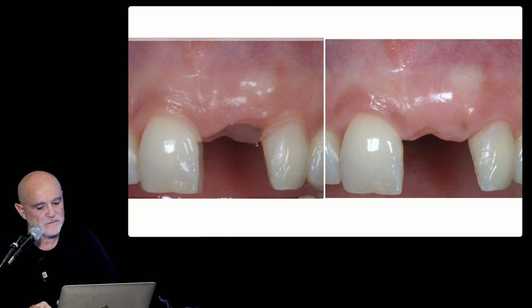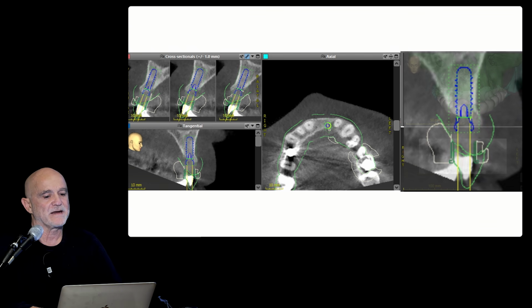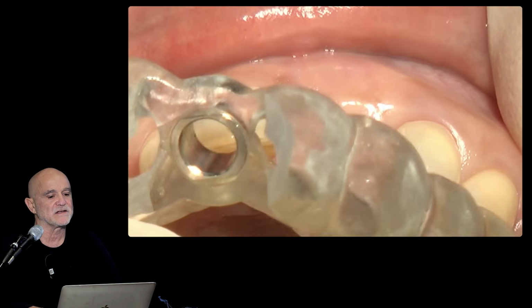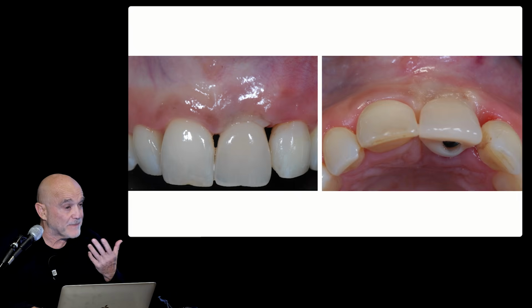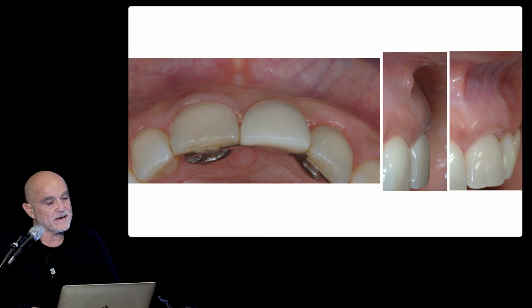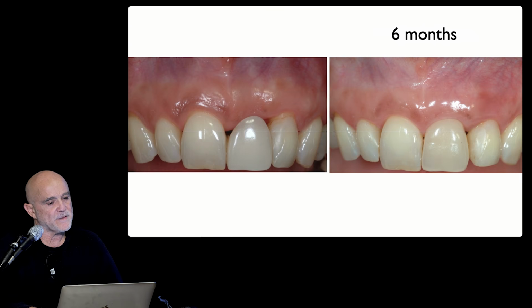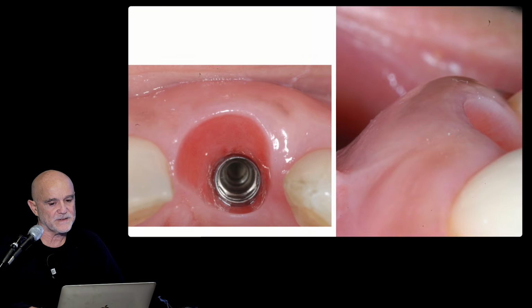So now the soft tissue is perfect, so we can plan our implant placement. The bone is obviously perfect because we waited so much. We can place our implant flapless. We can make the conditioning of the tissue. This is the patient before, this is after the soft tissue augmentation. This is the papilla before, this is after soft tissue augmentation and implant placement.